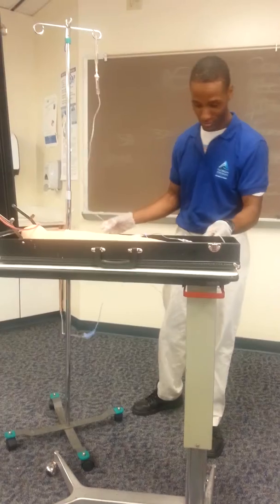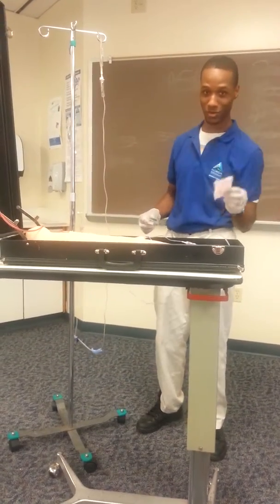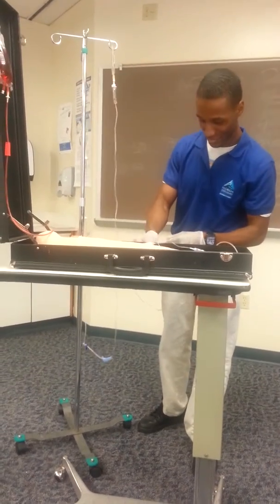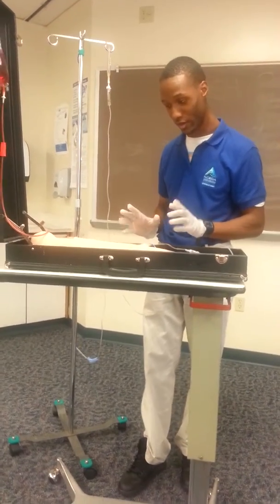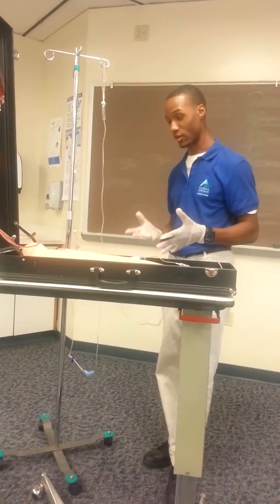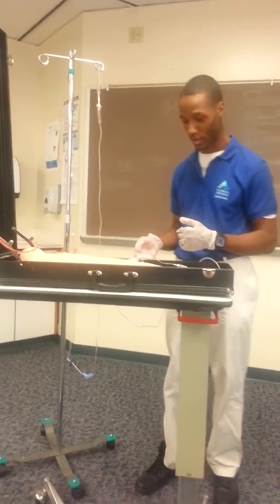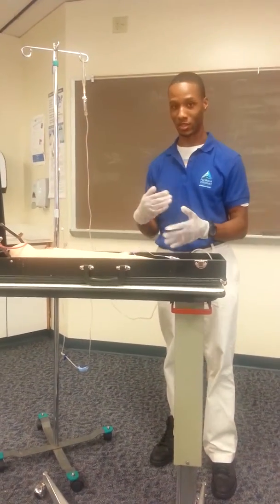I've done so. The label will still be on there as stated before. This is just a piece of paper. Label's on here, and I will also label my tubing, initial, date and time. And I would again assess the site. No irritability, bruising, swelling, any discomfort. I would check the patient's position. Do you have to use the restroom, any pain? Give the patient a call light and let the patient know that I will be back within the next hour or so to check on the patient.